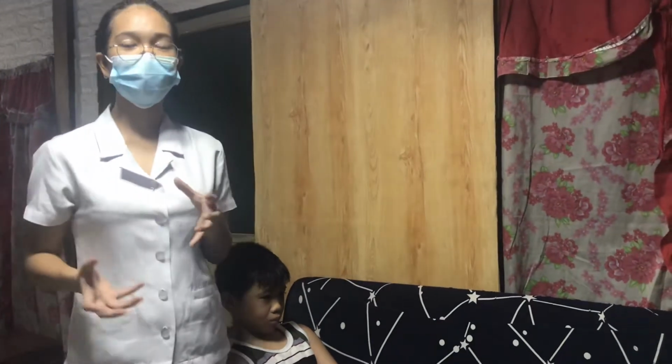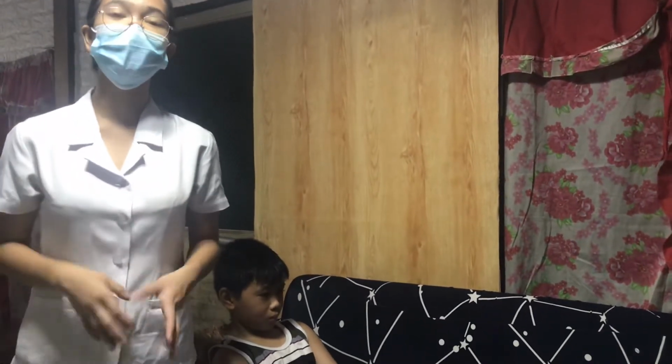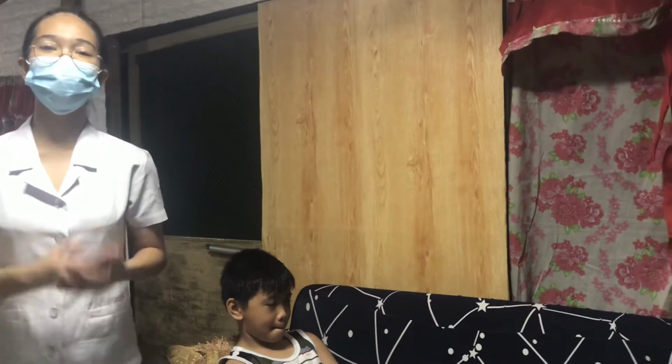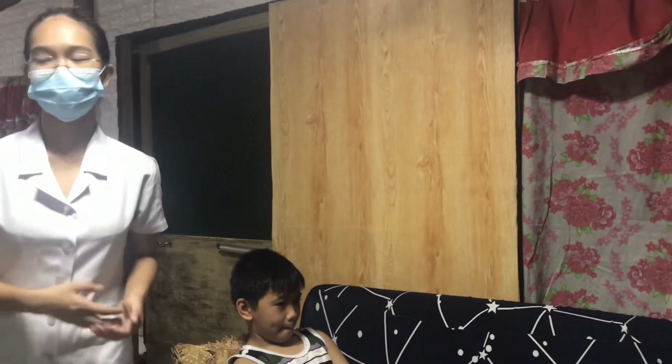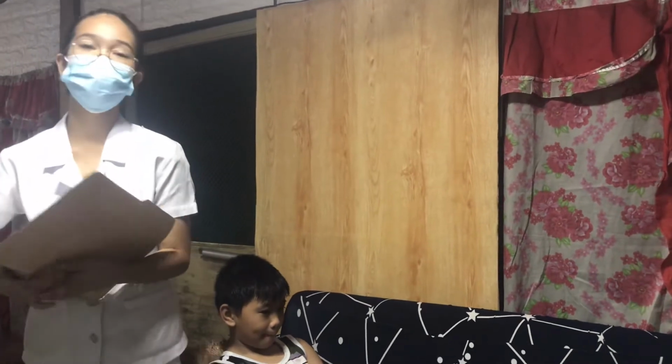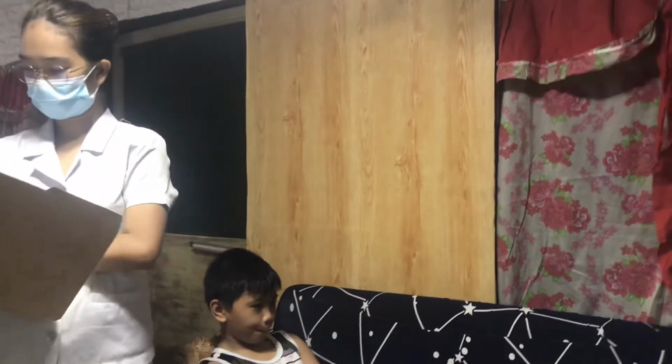So next, after the intradermal, we'll proceed to the subcutaneous. First thing to do again is to check the doctor's order on the patient's chart. The rationale for this is that the patient's chart is more reliable than a medication ticket. So again, I will be validating the doctor's order.